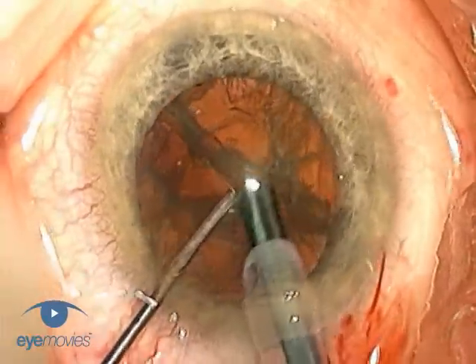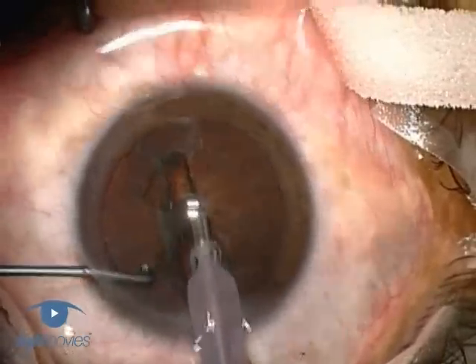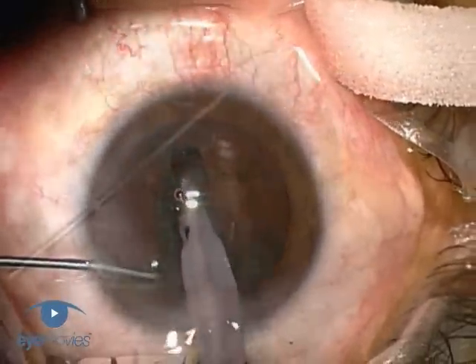Stop and chop is the former, and was originally outlined by Paul Koch, who described a central sculpting of the nucleus, then stopping, and changing to a chop technique.